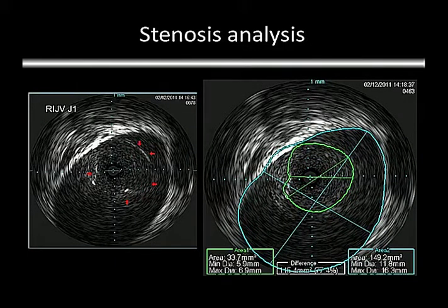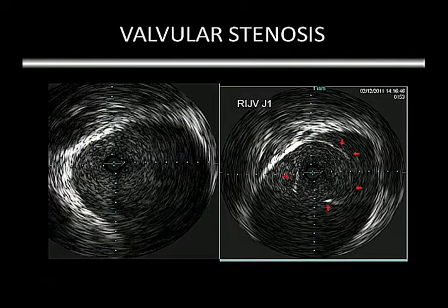And in this one, depending on how you view this vessel, you might use an 18 millimeter balloon or 20 millimeter balloon, and here you might use a 14 millimeter balloon for the same vessel. I think that we really can be precise to a greater degree by using cross-sectional area in determining balloon size. Another one here, this is pretty straightforward. That's the valve, and that's the vessel. So you can get a much better degree of stenosis.